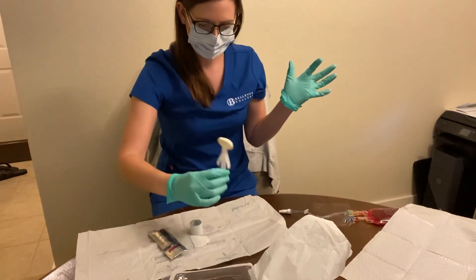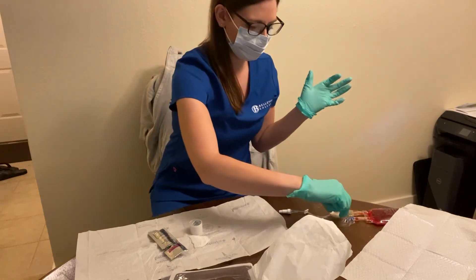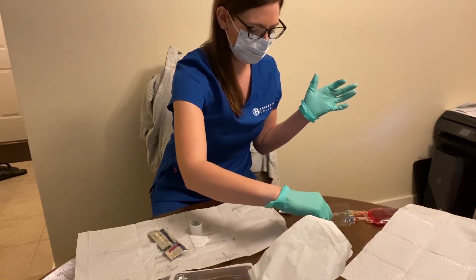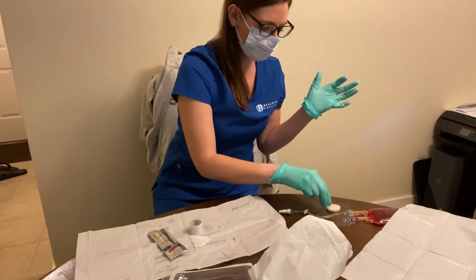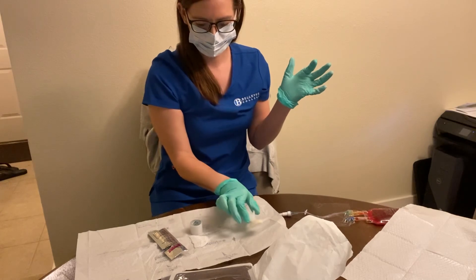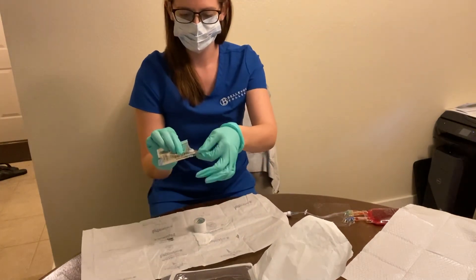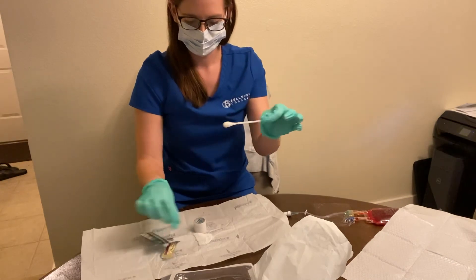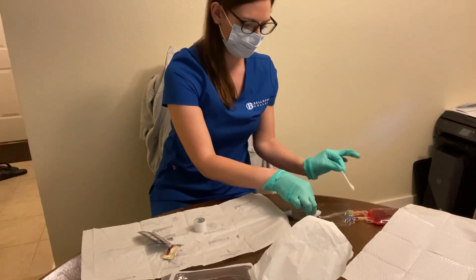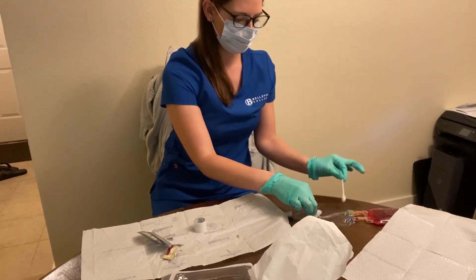First, I'm going to take my Chlorhex solution, crack it, and then go in a Z formation away from the line. Then I will grab my alcohol swab, lift the line, and go down, making sure to clean the whole line and underneath.